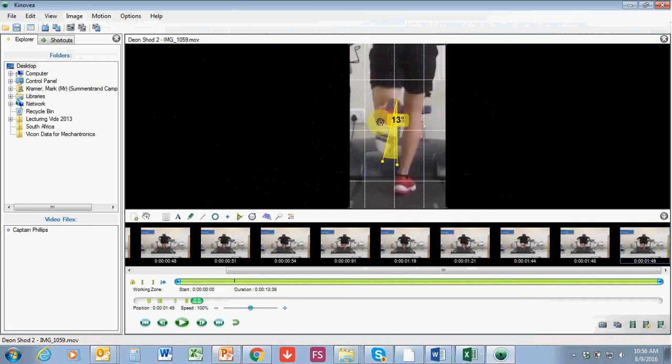So you have to start thinking about, well, what can be causing this. Remember, part of this is as a result of what's happening during stance. So it's already during stance that you need to be thinking about what is going to be causing consequences of this medial heel whip. So again, maybe stability issues, pronation issues, deep muscles of the lower leg issues that may need to be addressed. Okay, so again, I would screen capture this, compare left to right sides.